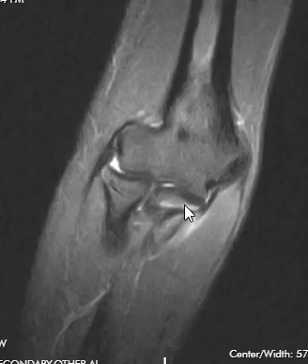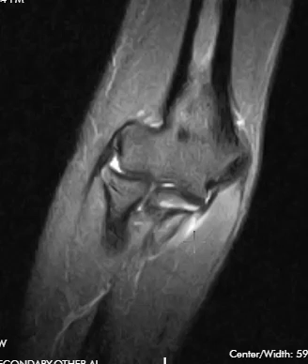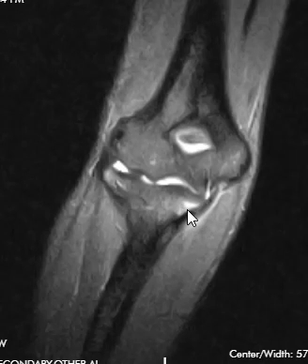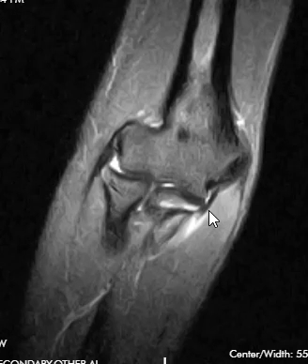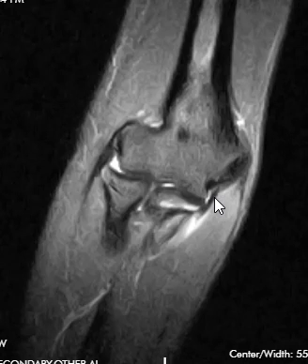Now in this sequence, marrow and fat appear dark — the only thing that's bright is fluid. There's a little bit of fluid in the joint that really lights up, telling us something is wrong. Also, over at the sublime tubercle area there's a little brightness which is not normal. Looking at where the ulnar collateral ligament attaches, there is marrow edema right at the attachment, the ligament is a little thickened, and there's a wisp of brightness in the deep soft tissues overlying it. This is an injury of the ulnar collateral ligament — it doesn't appear completely torn, but there is marrow edema and thickening, and this is something an orthopedic surgeon would definitely want to know about.